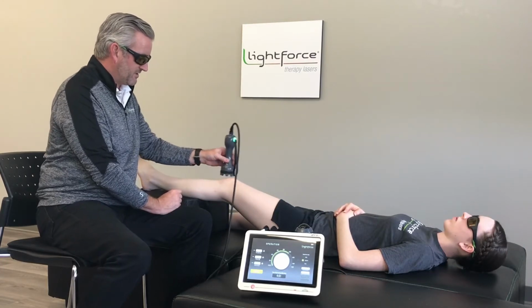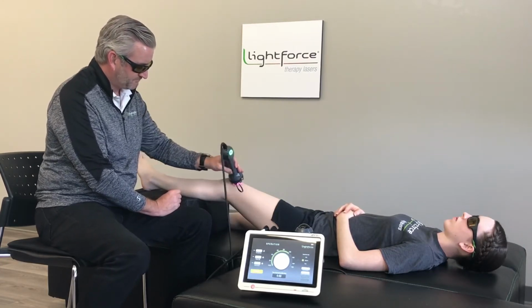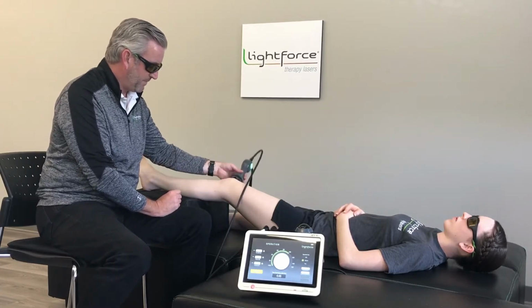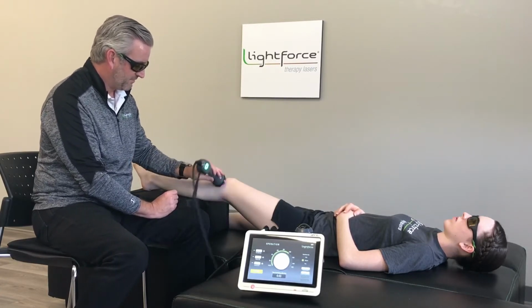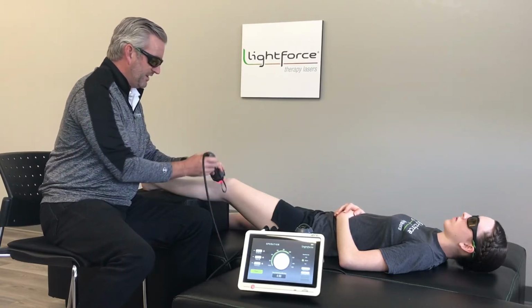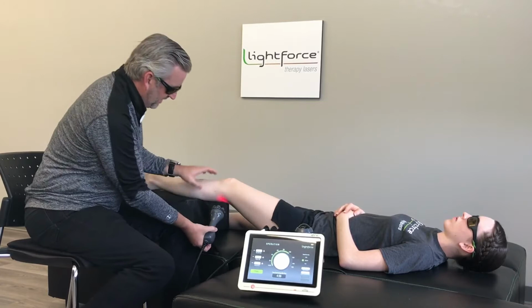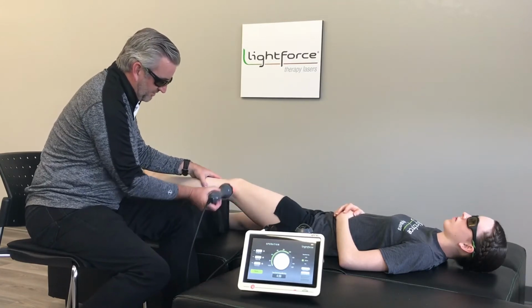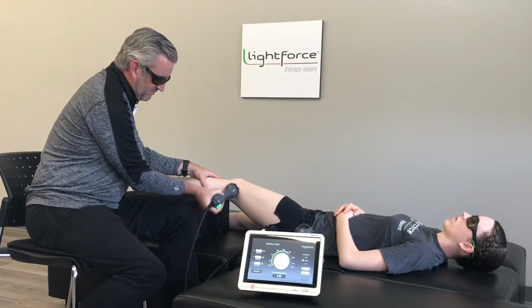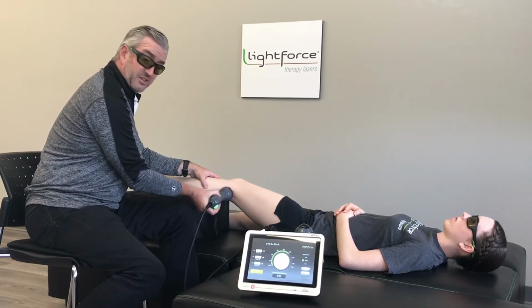You're going across hatch fashion, almost as if you were trying to paint that tissue with a spray can. You may, when getting to the back of the knee, have to change position. You may even have to have the patient move their leg a little bit so that you can get access to that posterior aspect of the knee as well. Just use your clinical judgment.